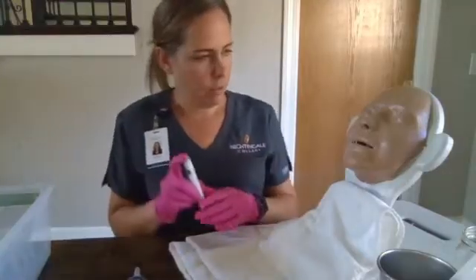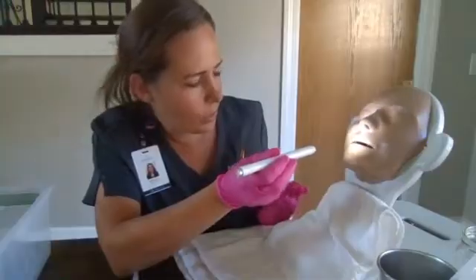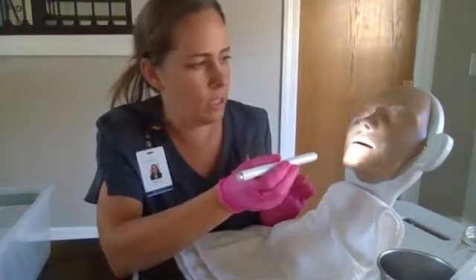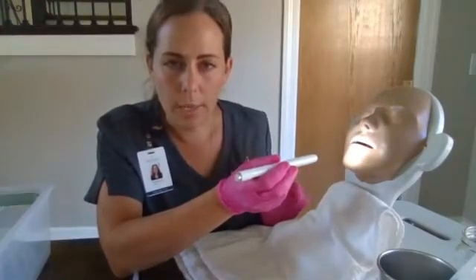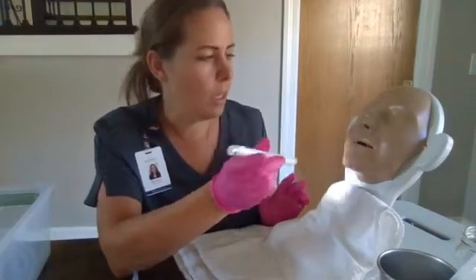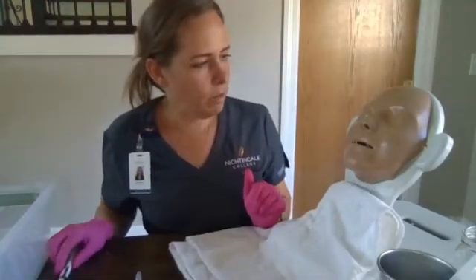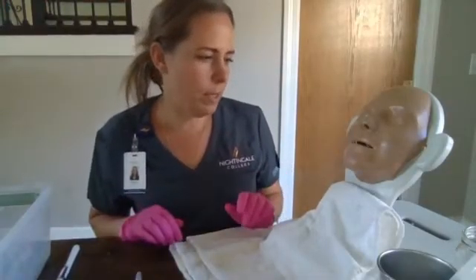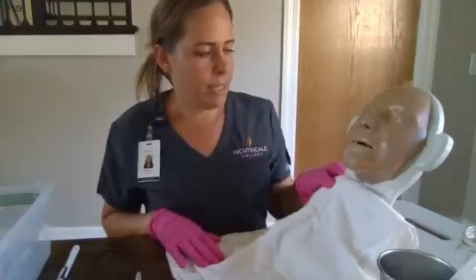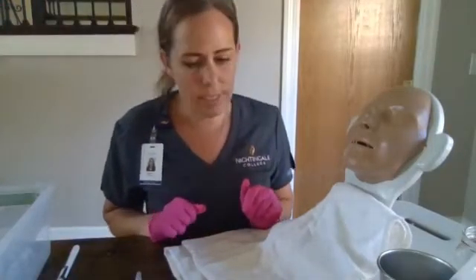Mr. Smith, will you look up? We're going to inspect the nares. We're looking for any obstructions, deformities, looking at the membranes for any redness, swelling, or abrasions. Mr. Smith, will you cover one nostril and take a deep breath in and out? Cover the other nostril, take a deep breath in and out. It sounds like that left nostril has better airflow, so we're going to use that side today.